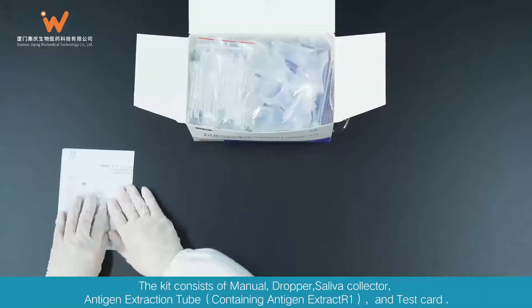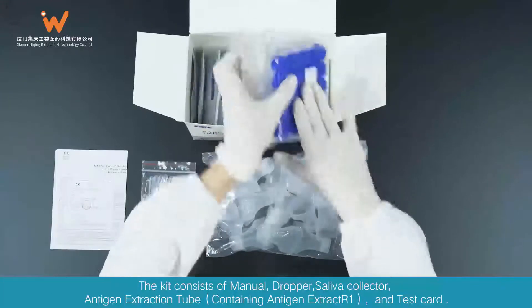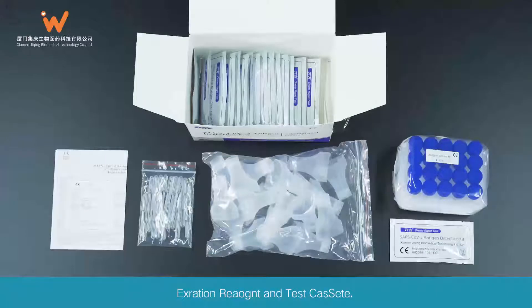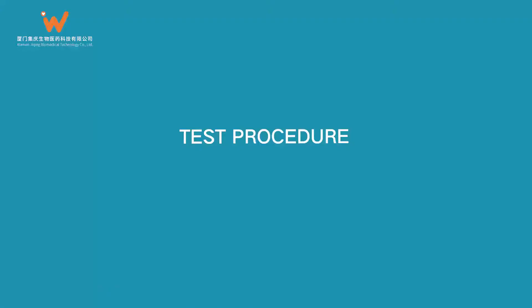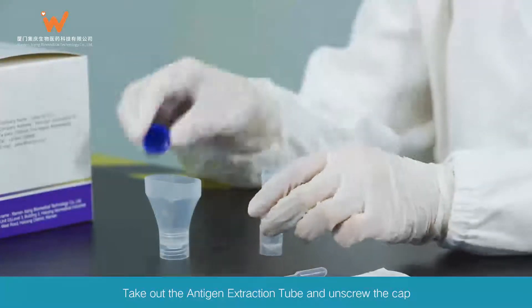The kit consists of a manual, dropper, saliva collector, antigen extraction tube containing antigen extract R1, and test card.